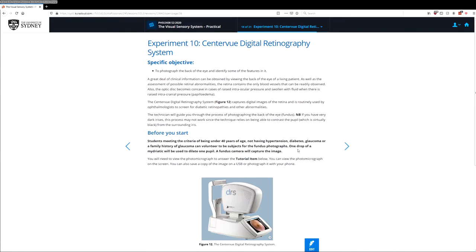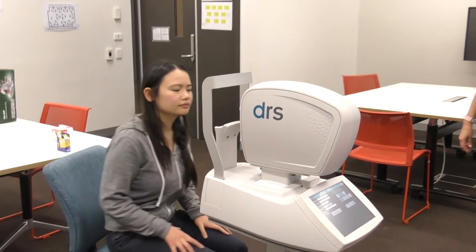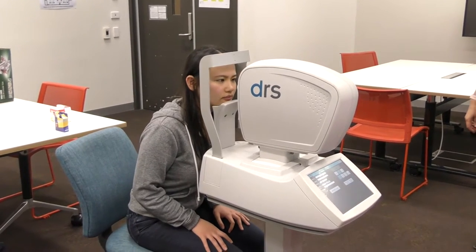What we would ordinarily do in class is to have each student sit at this camera and then take a picture of their retina, and then go through as a group what the structures are that we're seeing in those photographs. So let's do that now — we've got our subject seated at the camera.